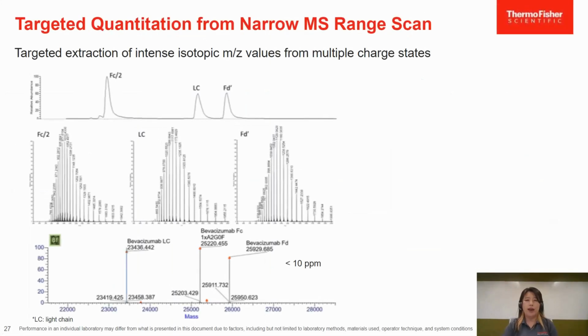And further, we optimized the mass spec method because I don't want to target the whole series of the isotopic clusters. I wanted to really focus on certain ions to gain the signal intensities and accurate quantitation.